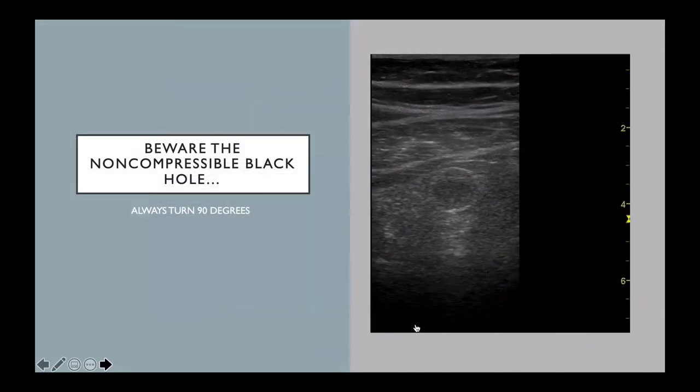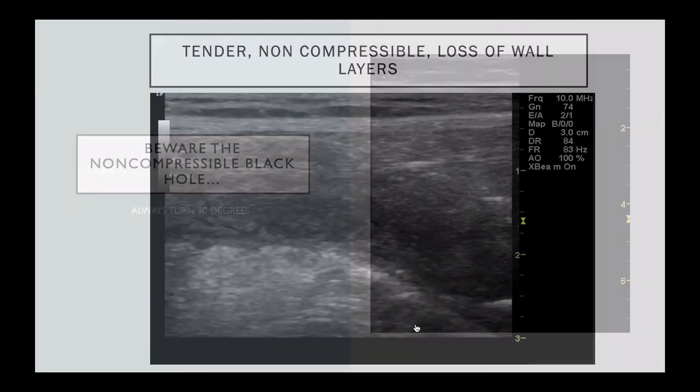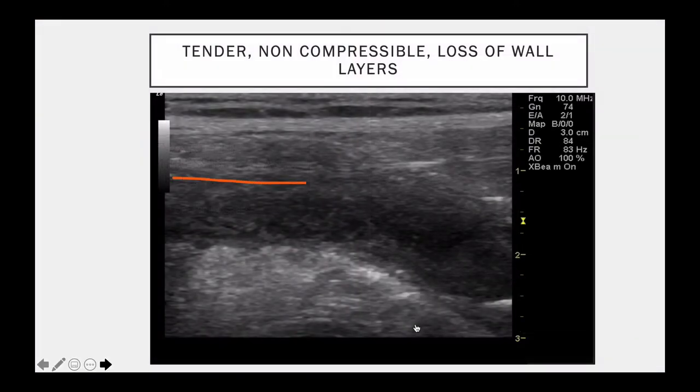Now, do be a little bit careful. Sometimes you'll see a tender black hole like this. This is why you have to turn 90 degrees. This one turned into this, which was a tender, non-compressible, blind-ending, non-peristalsing tube, and it actually lost all those internal wall layers because it had become gangrenous.